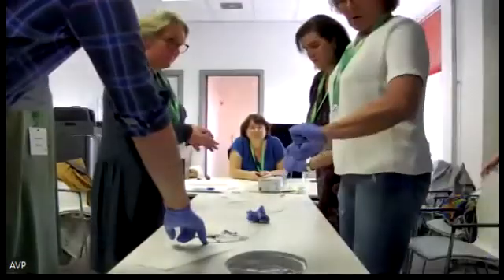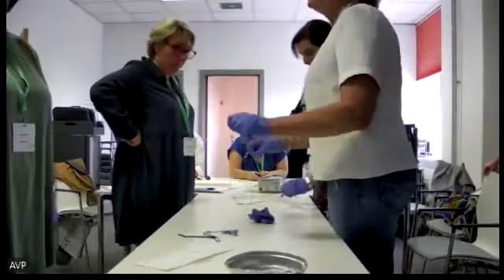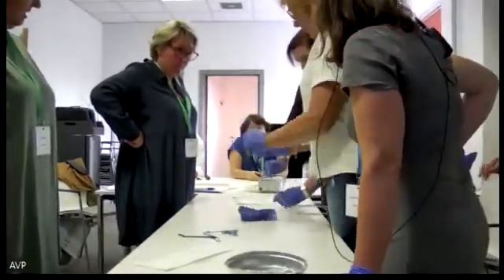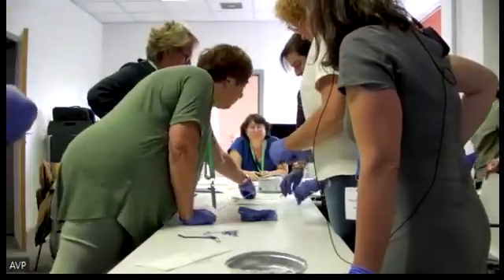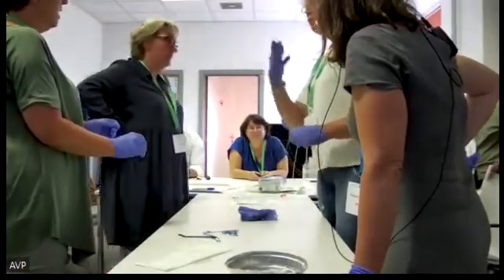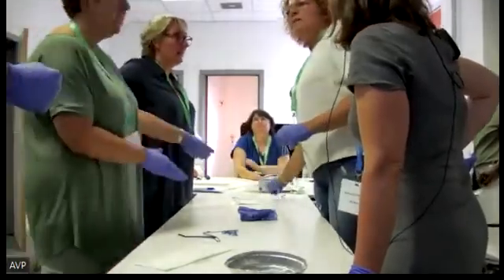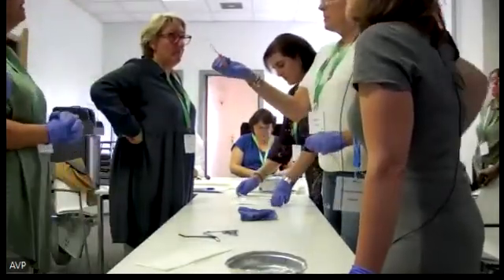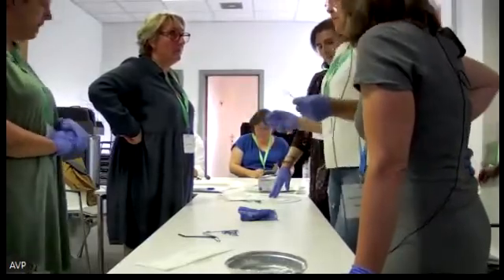Do you have the Torx? So you know, it isn't necessary to take this out, because for the 8.5 French, this is too floppy. It doesn't help you. This one is the 10. It's not necessary, but you can put the guide wire back. It doesn't help this one. But this one helps, it's more rigid.